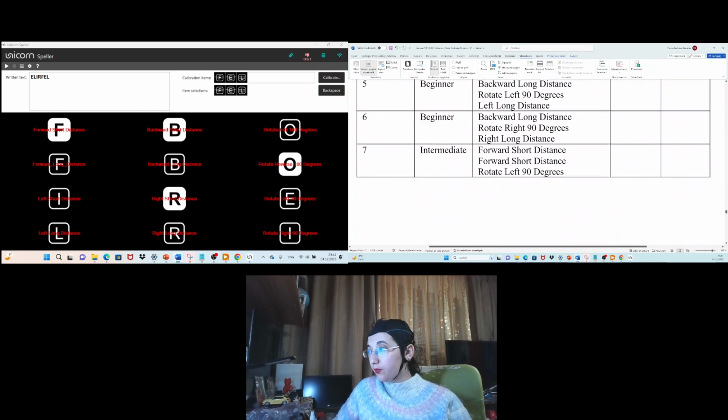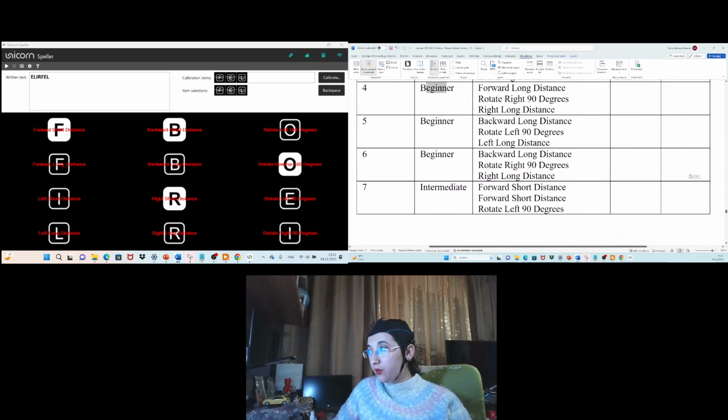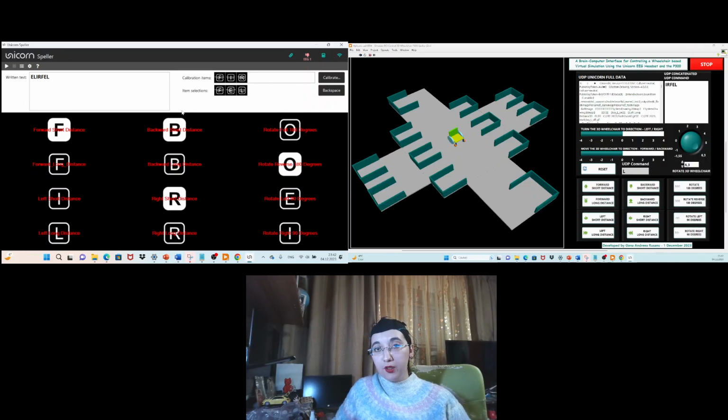Let's continue with the 4th experiments, beginner level. So here we have forward long distance, rotate right with 90 degrees, and right long distance. Okay, forward long distance, rotate right 90 degrees, and right long distance. I'll focus my attention and I will select these commands.